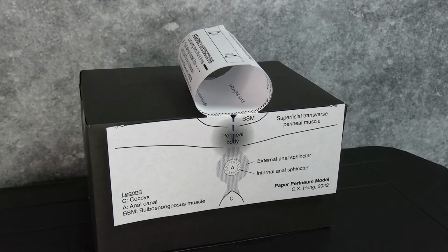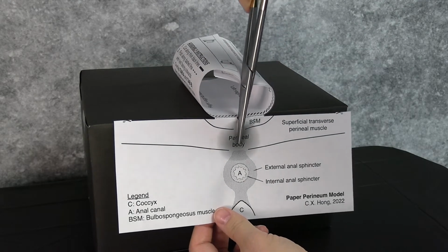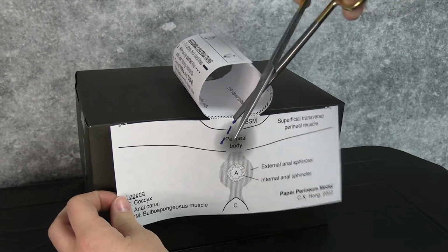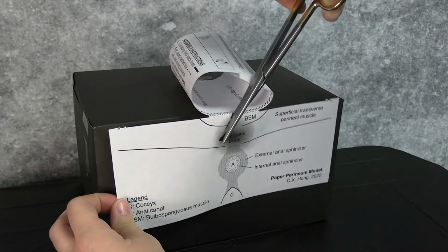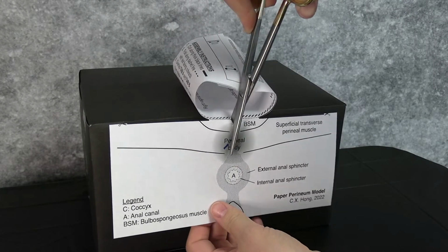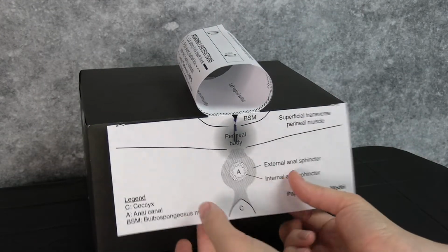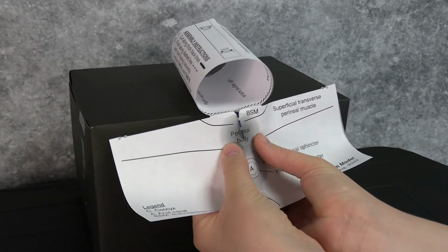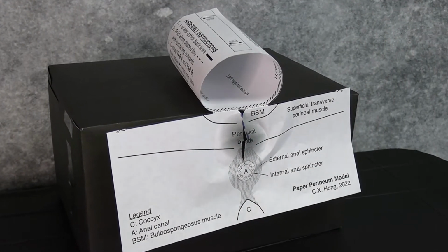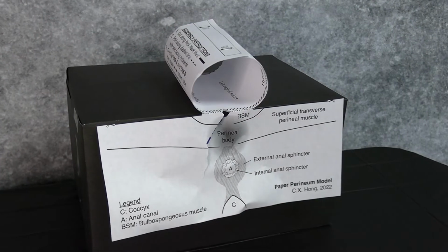Furthermore, the model can be used to simulate different types of episiotomies, such as a medial episiotomy, a mediolateral episiotomy, or a modified mediolateral episiotomy. With this, learners may appreciate how extensions of medial episiotomies are more likely to result in anal sphincter injuries compared to extensions of mediolateral episiotomies.